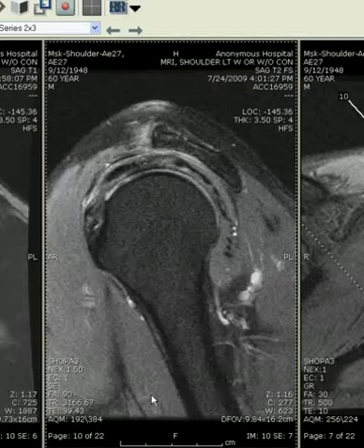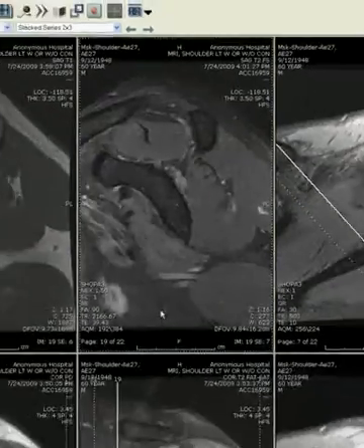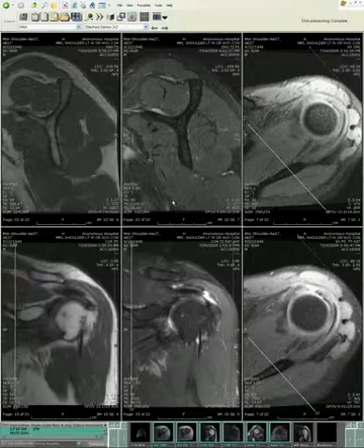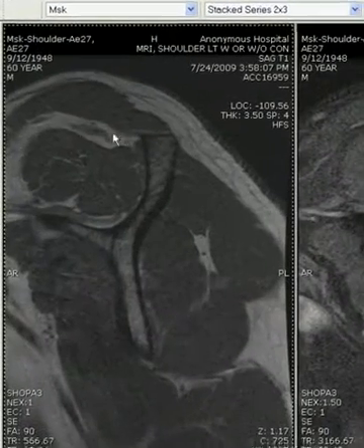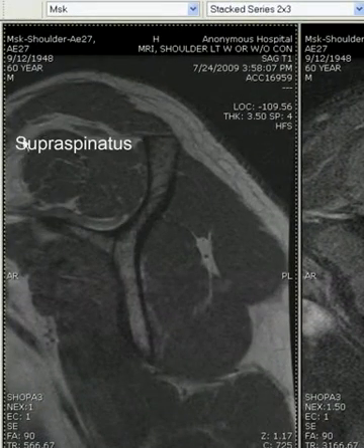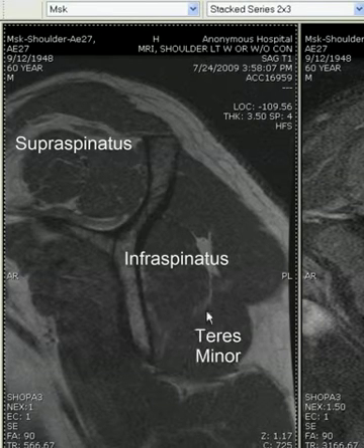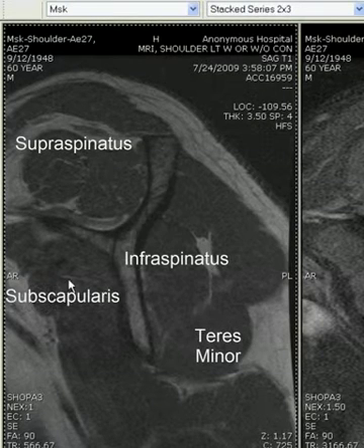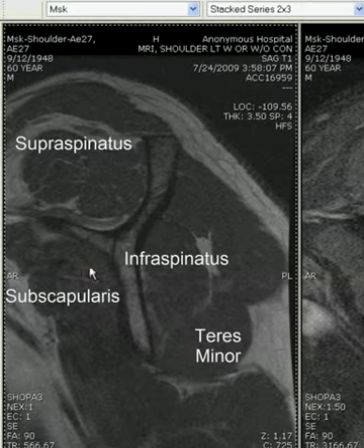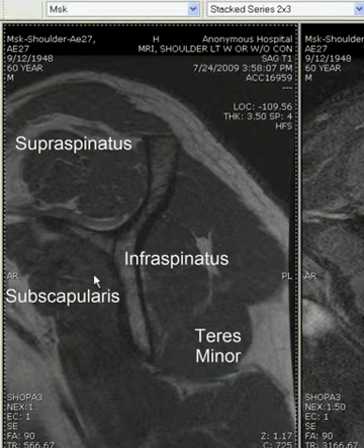If we look at the muscle bulk, it is important to look for atrophy of muscle. We can see the normal supraspinatus filling the majority of the outlet, the normal bulk of the infraspinatus, the teres minor, and the subscapularis as well.